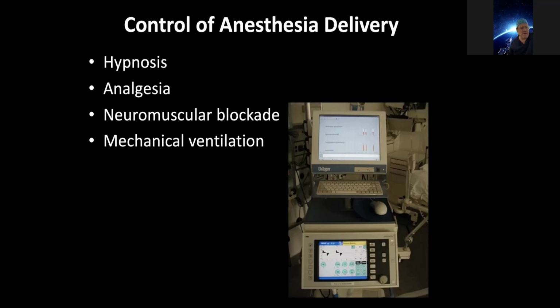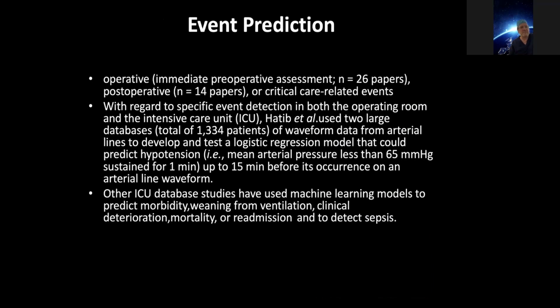A lot of the new machines for critical care ventilation and ICU ventilations, actually use mechanical ventilation, use some kind of artificial intelligence as well to predict, for example, when the patient can be weaned from mechanical ventilation, meaning that when is the patient able to breathe spontaneously. So there's a lot of artificial intelligence which is currently under investigation, not too much in clinical routine use, but there are definitely fields where artificial intelligence plays a role. I give you another example in the next slide, one which is in this one here, the event prediction.